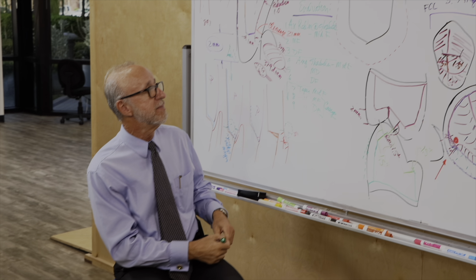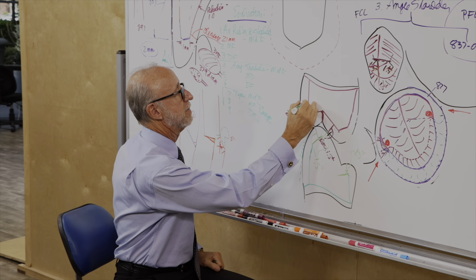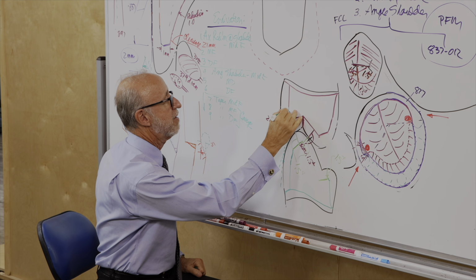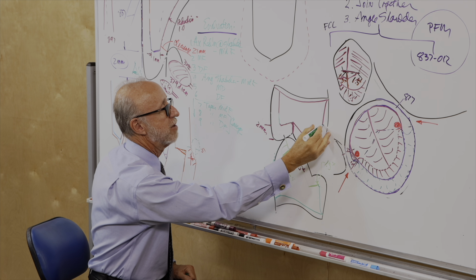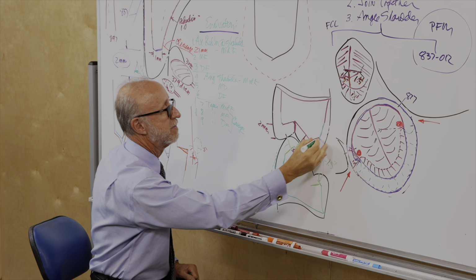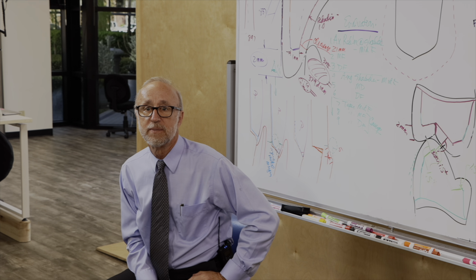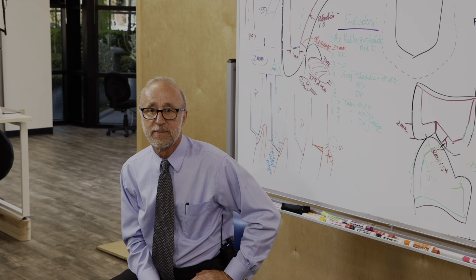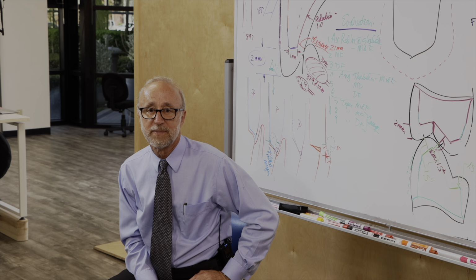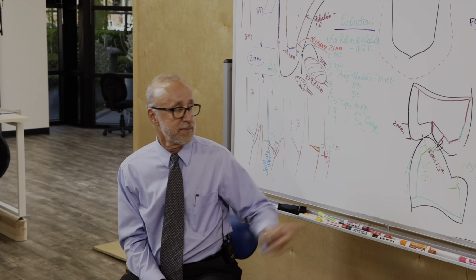In the lower premolars, the tooth is pretty lingually tilted, right? So even for the premolar, we'd expect a little secondary plane, something like this. Just like over here. So in the premolars, the lower first premolar, the crown tilts lingually. So if you give the taper, like let's say the C plane, how does the secondary plane work since the crown is tilted lingually? Just like this.